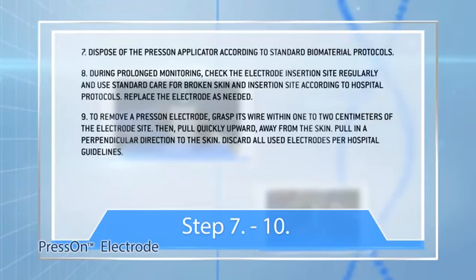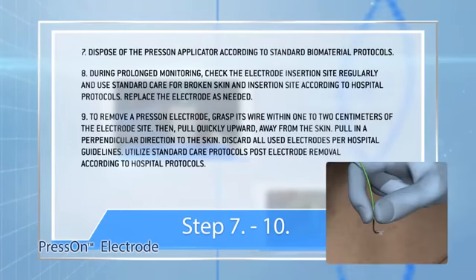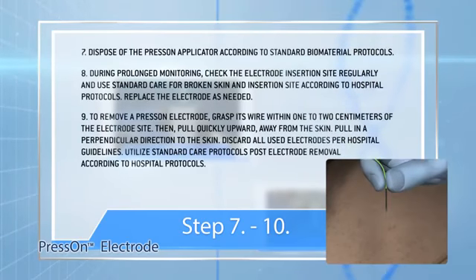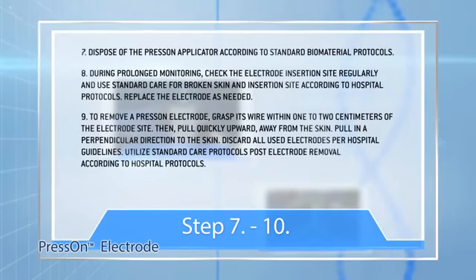Step 9: To remove a press-on electrode, grasp its wire within one to two centimeters of the electrode site. Then pull quickly upward, away from the skin. Pull in a perpendicular direction to the skin. Discard all used electrodes per hospital guidelines.